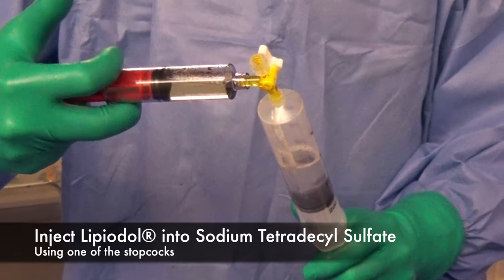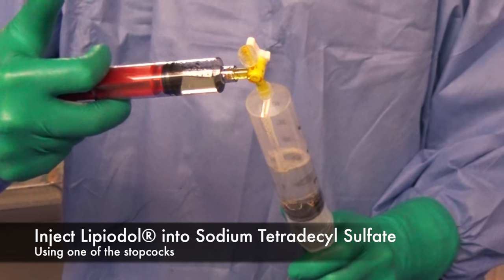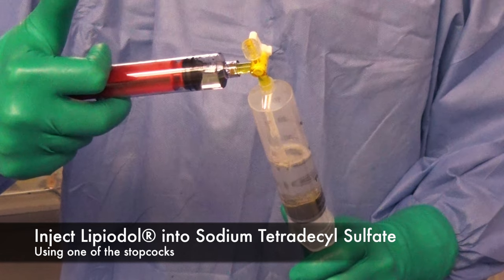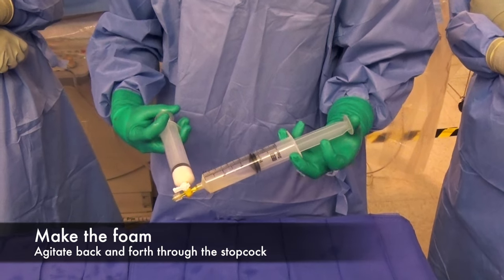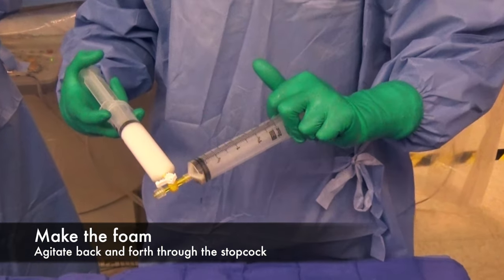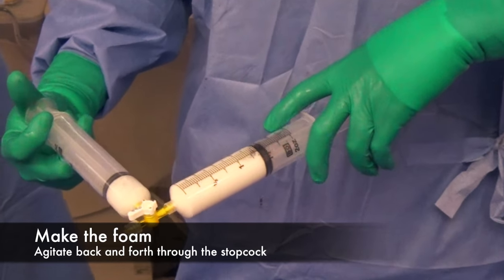Sotradecol is a detergent and will float on top of the Lipiodol when it is placed into the syringe. This will result in a layer of air on top of Sotradecol on top of Lipiodol. Agitate the mixture of air, Sotradecol, and Lipiodol back and forth to create the foam. The mixture will expand, leaving you with more than 60 milliliters of foam.